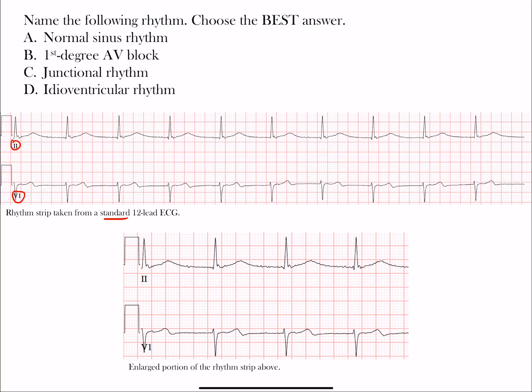We're only given two leads, shown in a large version to help you see the smaller squares and assist with finding the rate. Let's go through each answer choice. For choice A — normal sinus rhythm — in lead II we expect to see upright P waves. The normal P wave axis in sinus rhythm is about positive 60 degrees. In the horizontal plane, looking at the precordial leads in V1, we can sometimes see biphasic P waves.